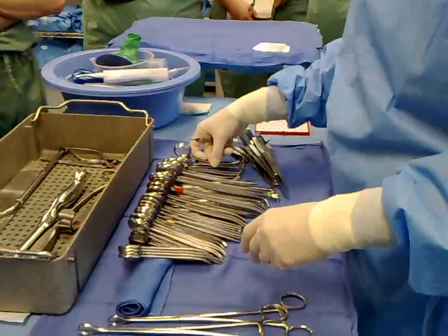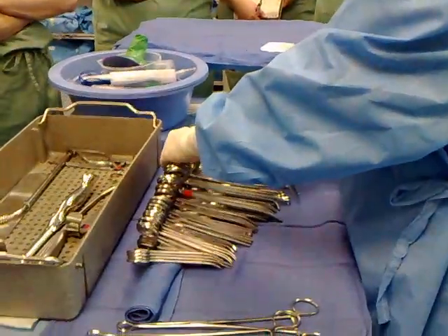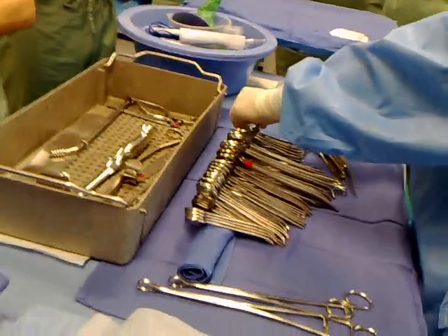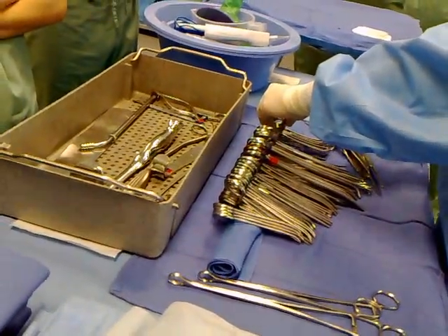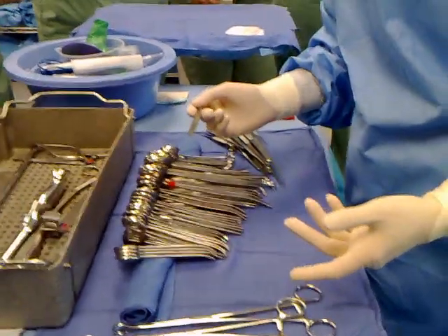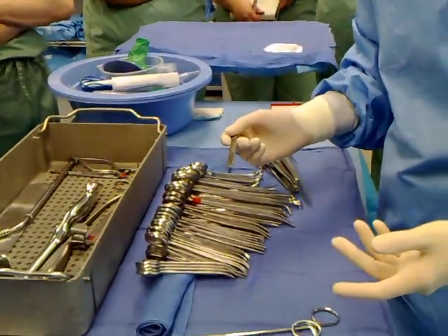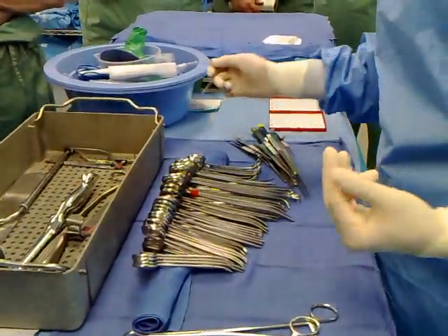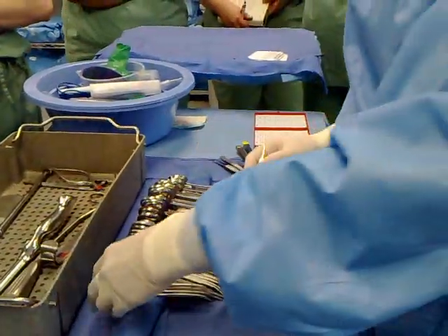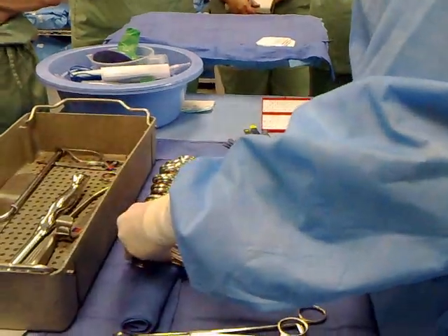So I'm supposed to have towel clips. Two, four, six — or you can count one, two, three, four, five, six. I have six: four perforating and two non-perforating. That's where you have to make the change if the count doesn't match.